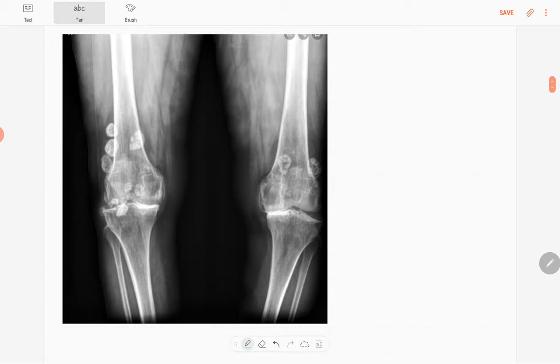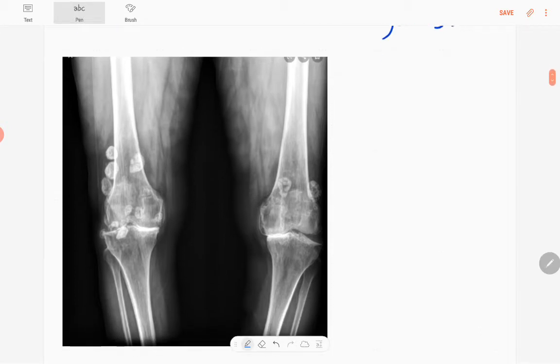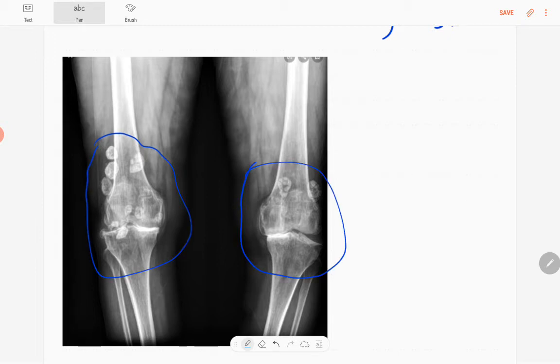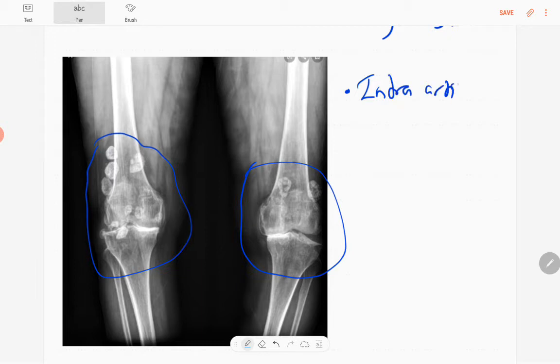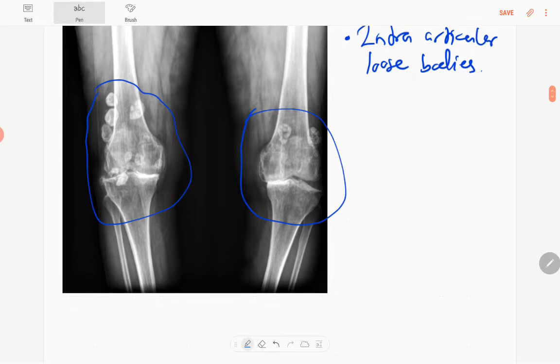This is the anteroposterior radiograph of both knee joints in a skeletally mature patient. You can see abnormalities in both knee joints. There are multiple rounded radiopaque structures in both knee joints — we call these intraarticular loose bodies. Bone density and trabecular pattern are normal in these bones.